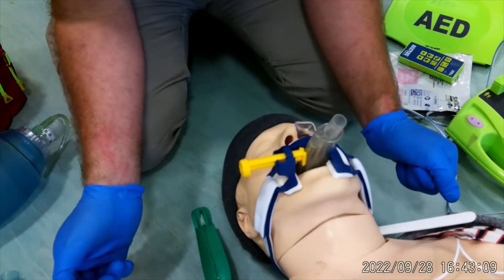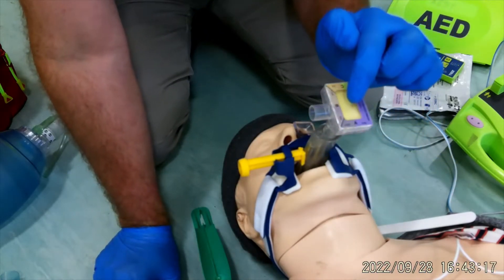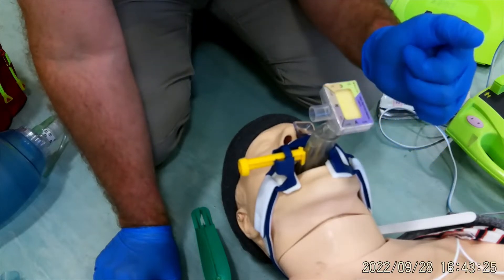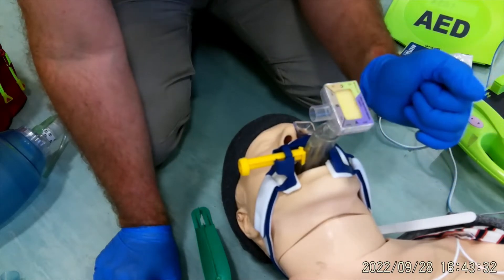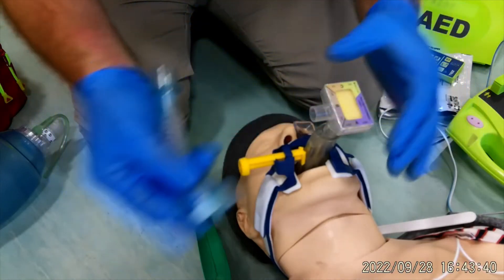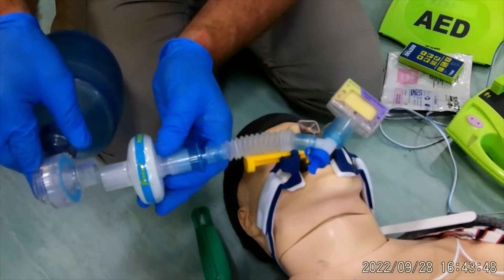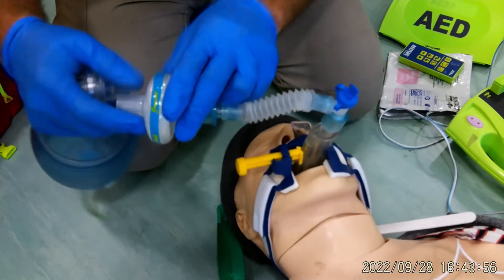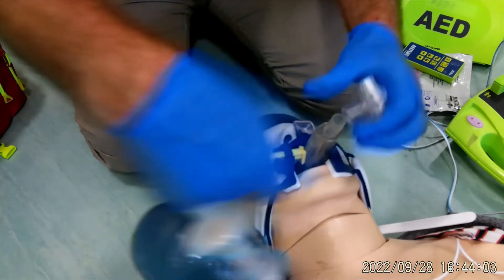The next thing is to put a colorimetric device on top. When new, it starts purple — if CO2 is coming out it will change to yellow. If I had waveform capnography on a monitor I wouldn't need this, but as I don't, I'm using the colorimetric on this occasion. I then extend the catheter mount — a flexible tube — and place it onto the colorimetric, add a filter, and the bag valve and mask goes on the filter. If using a monitor, waveform capnography would go after the filter before the BVM.